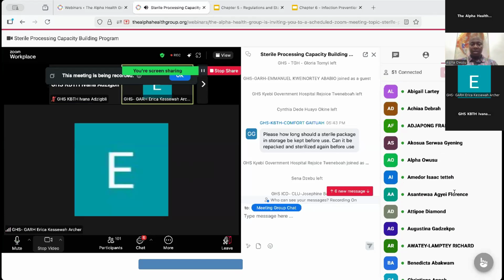Sorry. The paper wraps that you have been using, go and check the manufacturer's instruction. We have what we call shelf life and sterilization life.